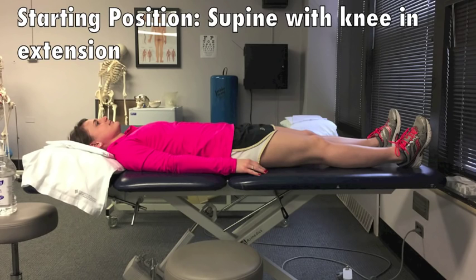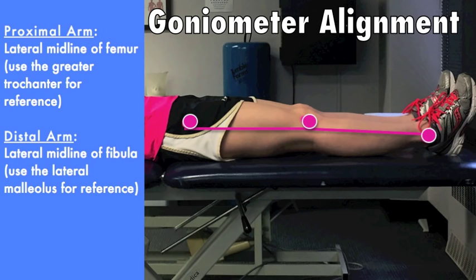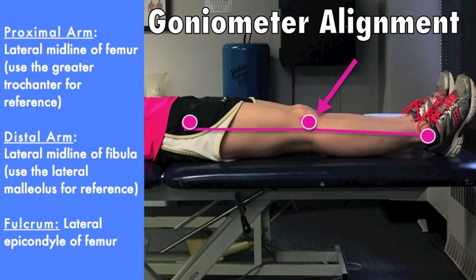Start with the patient in supine with their knee in extension. Align the proximal arm with the lateral midline of the femur using the greater trochanter for reference. Align the distal arm using the lateral malleolus for reference. The fulcrum should be the lateral epicondyle of the femur.